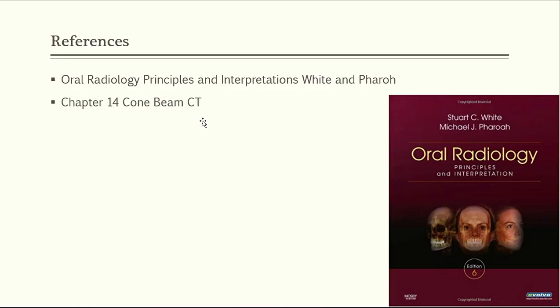And I took some material from White and Pharoah's Oral Radiology: Principles and Interpretation. So hopefully it was a good lecture. It's very short, but I tried to make it more clinically oriented and to help guide you through seeing a CBCT scan. The more you see CBCTs, of course, the more you will be able to assess them better. And thank you. If you have any questions, I'm always available.